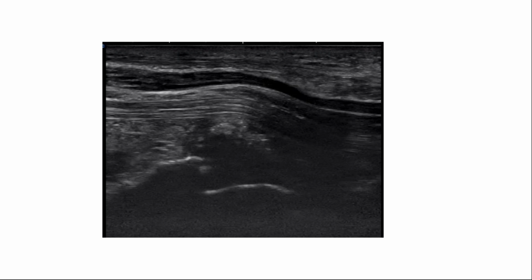So if you remember imaging the median nerve in long axis, how does it appear? You see the tendons and then you see the median nerve over that. But look at this median nerve. It goes up like this and then it goes, it's almost as if it's curving around the tendons. And the tendons are also curving around something. And look at this something here.